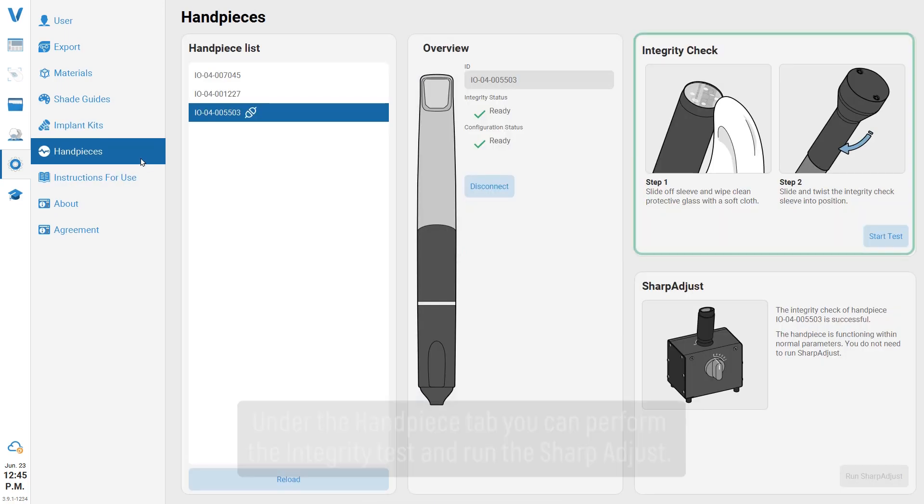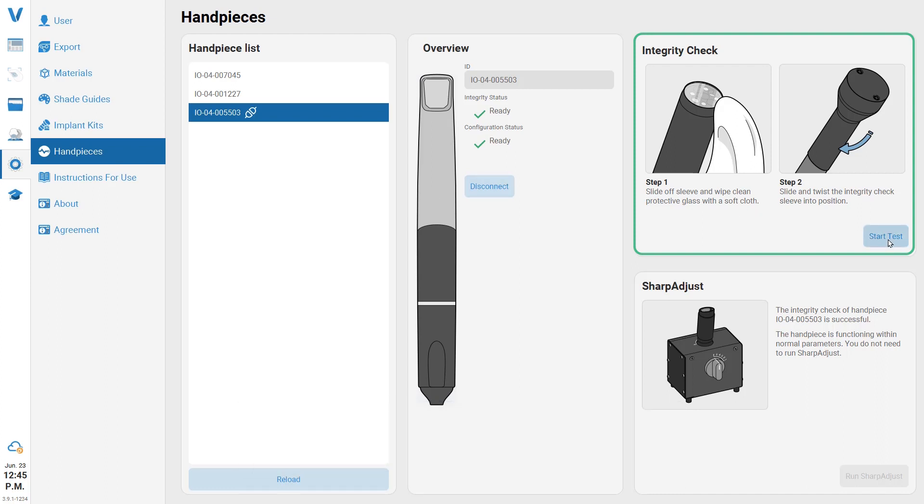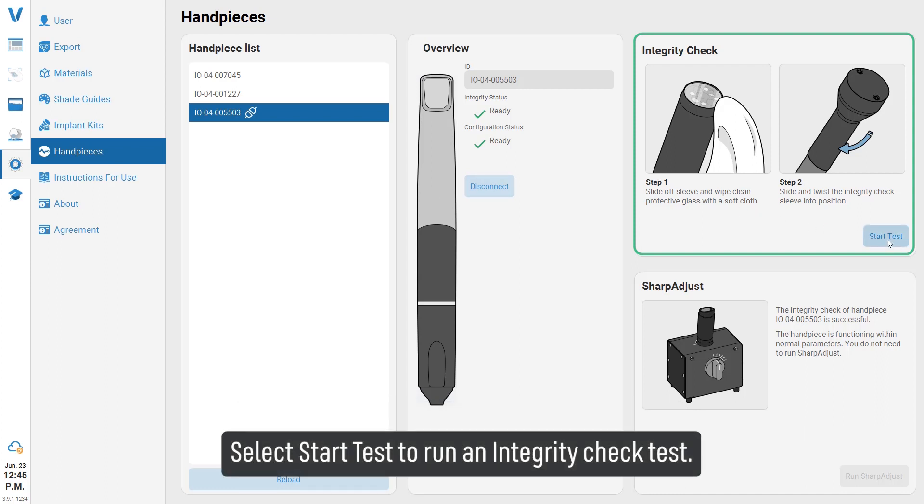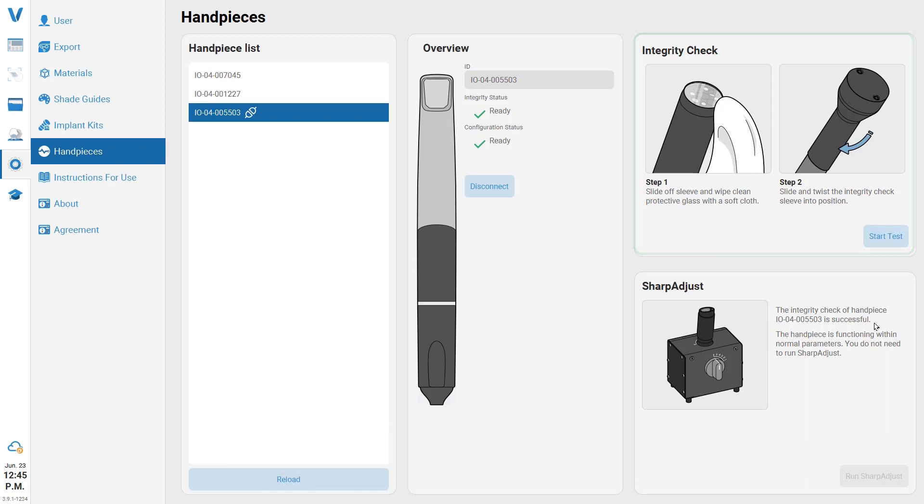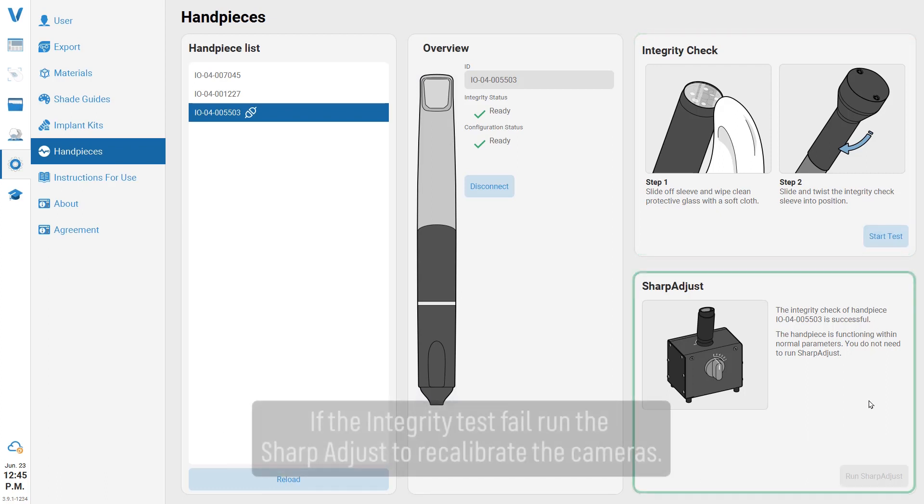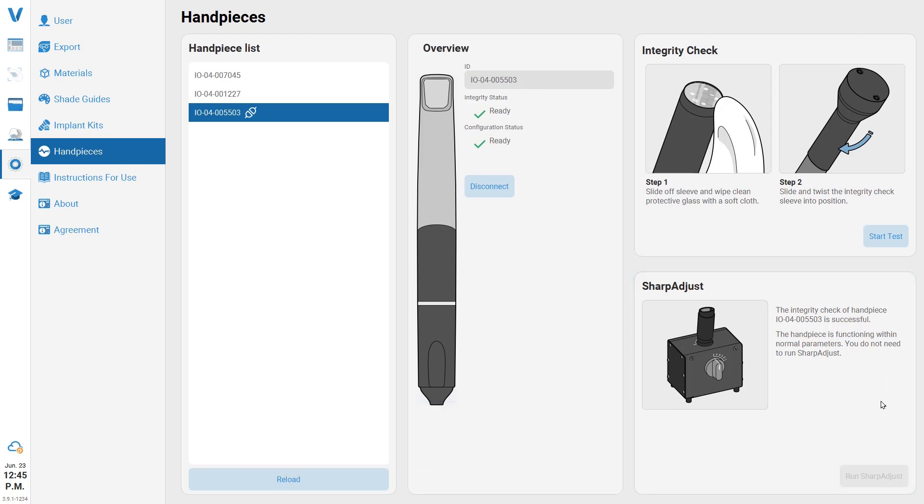Under the handpiece tab you can perform the integrity test and run the sharp adjust. Select Start Test to run an integrity check test. If the integrity test fails, run the sharp adjust to recalibrate the cameras.